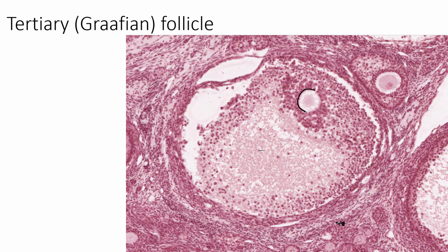It's decent. So here's our egg cell. Here is the corona radiata surrounding the egg cell. So this area here is the cumulus oophorus. You can see our granulosa cells out here, so this is the granulosa layer, and then out here you can see that theca as well with our single large antrum.